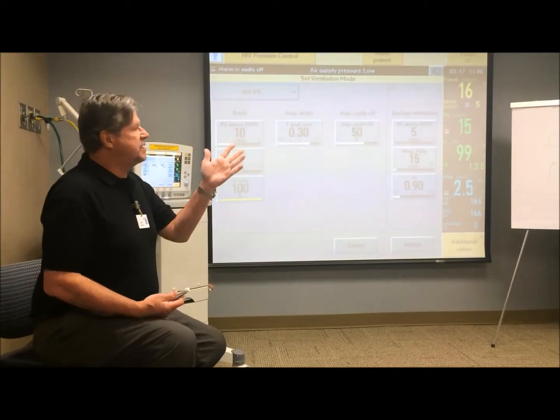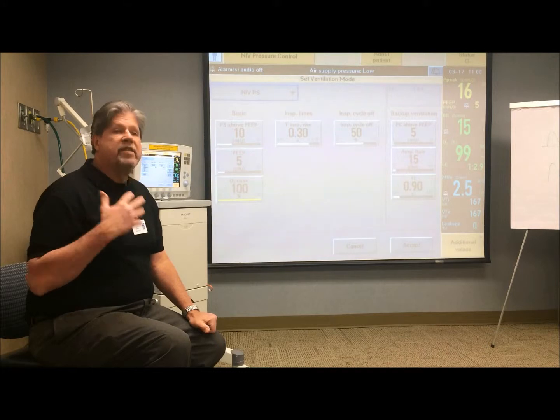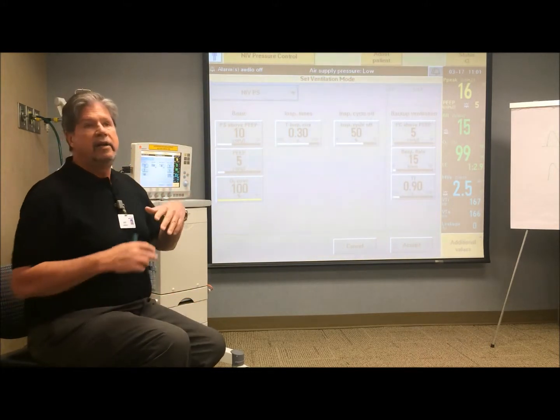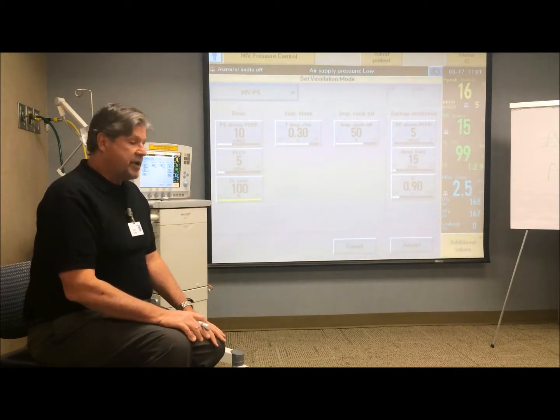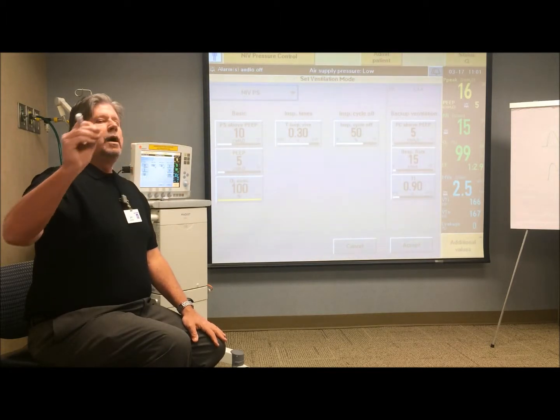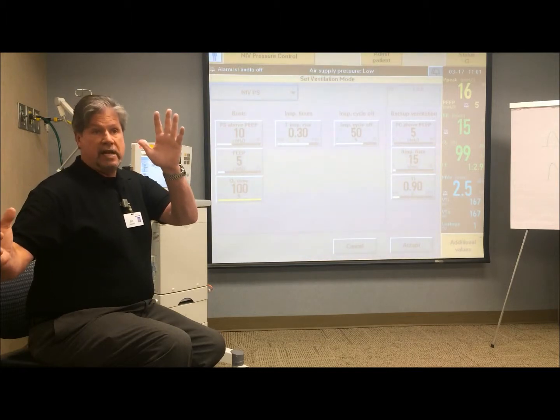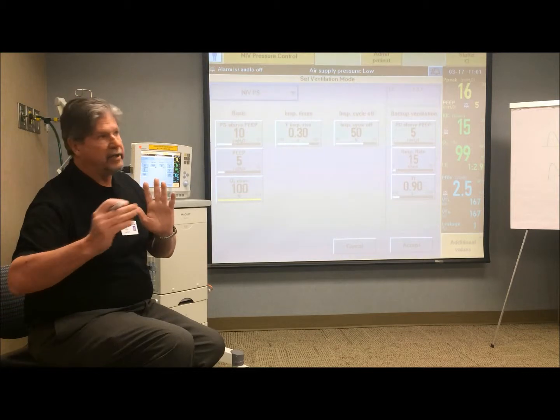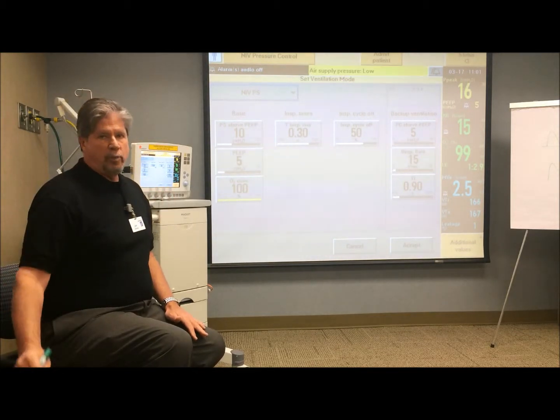And the other reason that you can use inspiratory cycle off is if you had a patient that was breathing very fast and his inspiratory cycle off was set at 50%, just in pressure support, and he's breathing fast, it means he's getting cut off too soon, but maybe he wants to take a longer breath, which would mean more volume that he gets. So if you decrease your cycle off point down to 20% or 15%, he can take a longer breath.